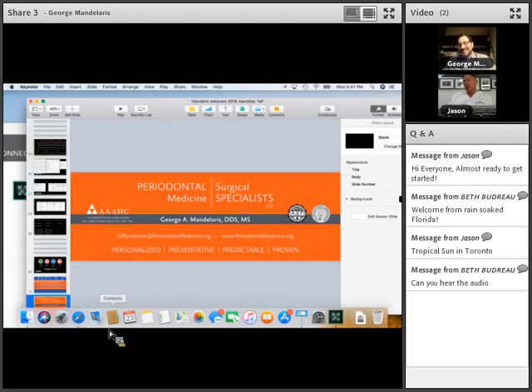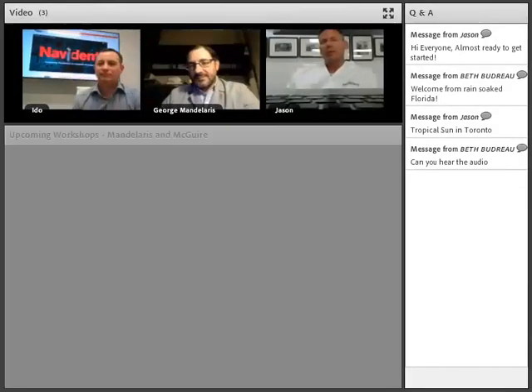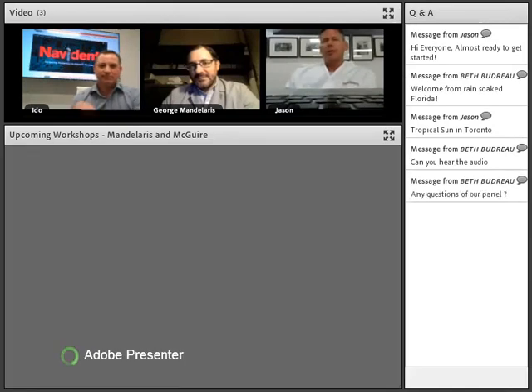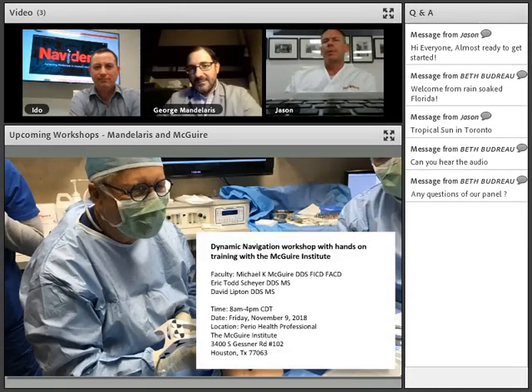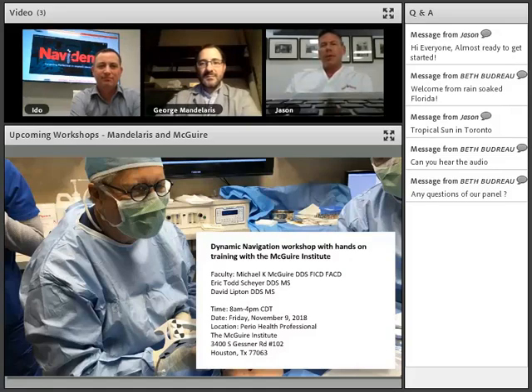But what I really appreciate, I always appreciate your presentation, and I especially appreciated what you just showed, in that you're showing the collaboration between people in different parts of the country and different parts of the world. So just on this call alone, we have Toronto, Abu Dhabi, the UK, Bolivia, Australia, Italy, and Chicago, someone in your town. So every one of these people has experience with the system, but it's in that sharing of what we do back and forth with each other that it's going to get better and better and better.